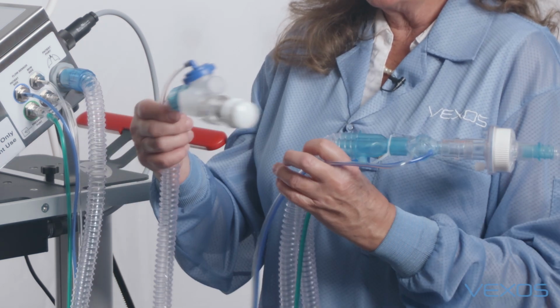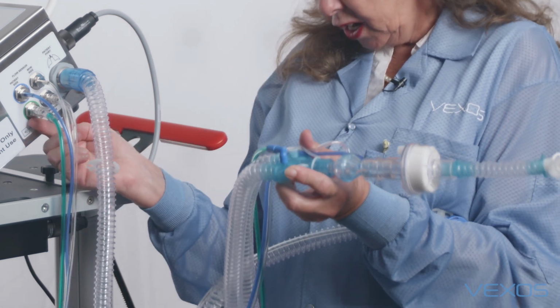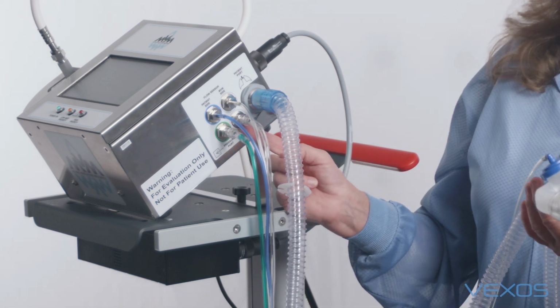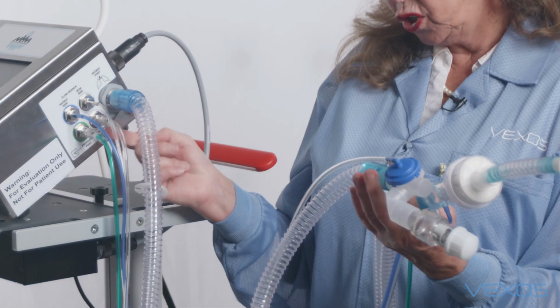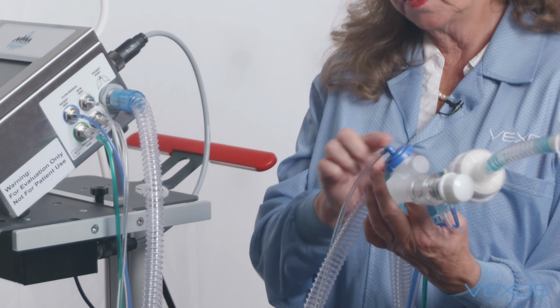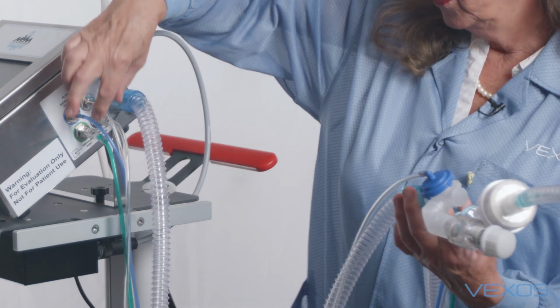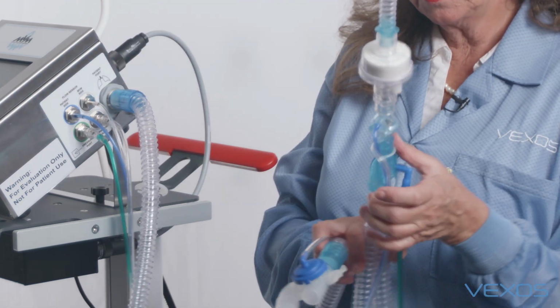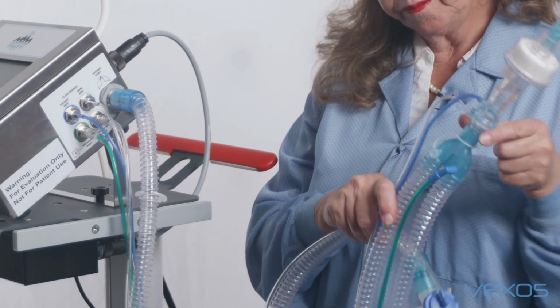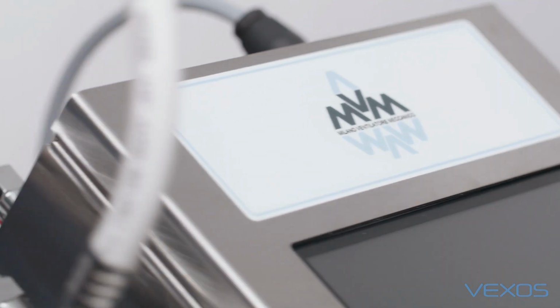Two more lines need to be attached. One is the pressure sensing line, which is attached underneath with a green corresponding color. And the expiratory valve needs to be attached via this port here. So that controls the expiratory valve. So there's 5 attachments to be done: the large patient port, the 2 flow sensors corresponding color-coded from the flow sensor, the green pressure sensor, and the clear expiratory valve line. The setup procedure has now been completed.